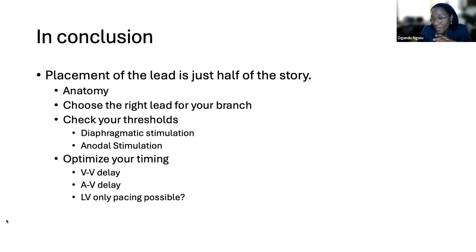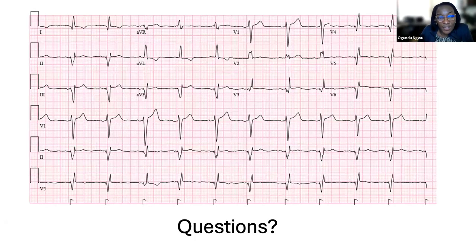I don't know who the other implanters online are. I don't know if EJ has any comment on that. But yes, I do use trigger pacing, because sometimes your rhythm is so irregular that you really cannot completely have them fully BiV paced without it, where you see the QRS and then you do the pacing once you sense the QRS complex.